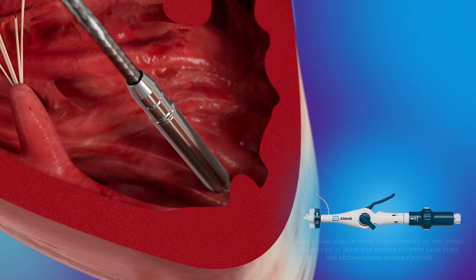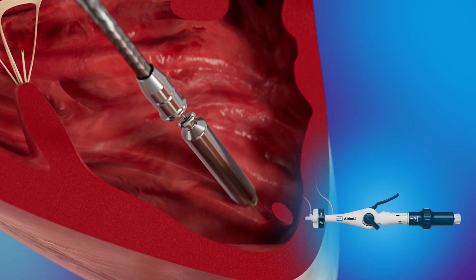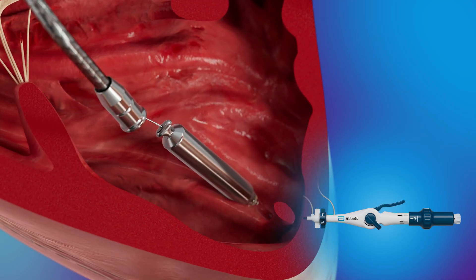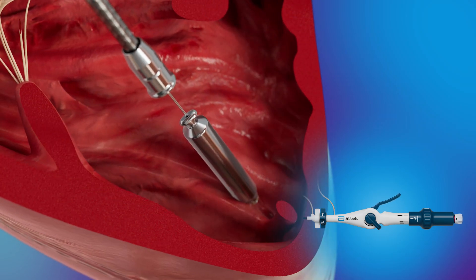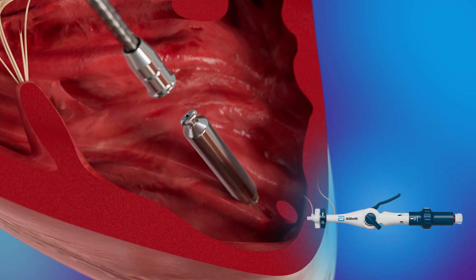The catheter is placed into tether mode to allow for final testing prior to release. Additionally, to verify stable helix fixation, a deflection test is performed. When ready to fully release the pacemaker, the catheter tethers are misaligned by pulling and rotating the white LP release knob half turn counterclockwise. The delivery catheter is then withdrawn.